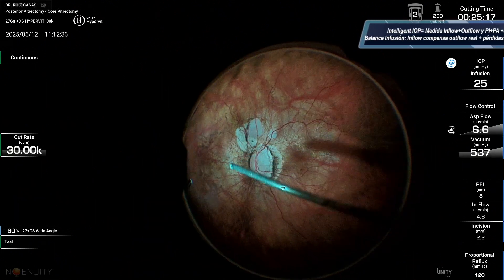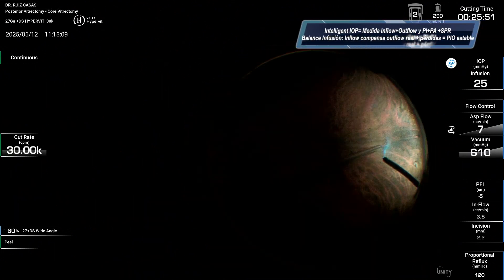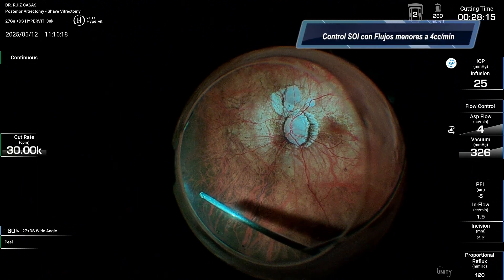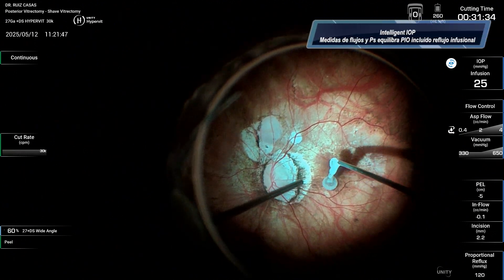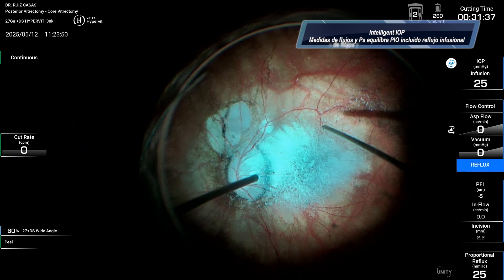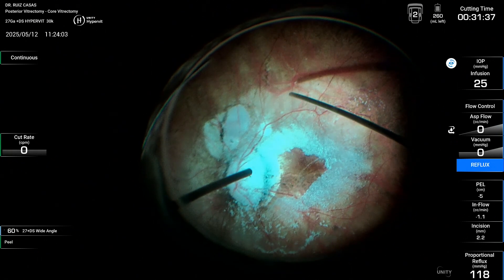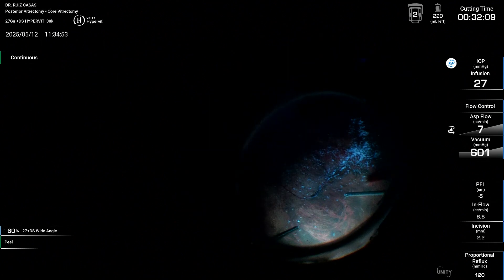And this was another case — another highly myopic patient with another macular pathology — and now I'm performing vitrectomy with 27G. It is super safe, as you can see: very controlled, no retinal tears. I can spare the vitreous adjacent to those areas of peripheral lattice, and now I'm injecting triamcinolone to look for vitreoschisis, washing it out, and after this I could remove some debris of vitreoschisis and epiretinal membrane.